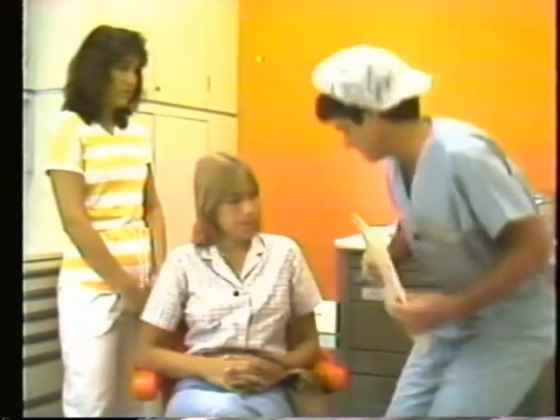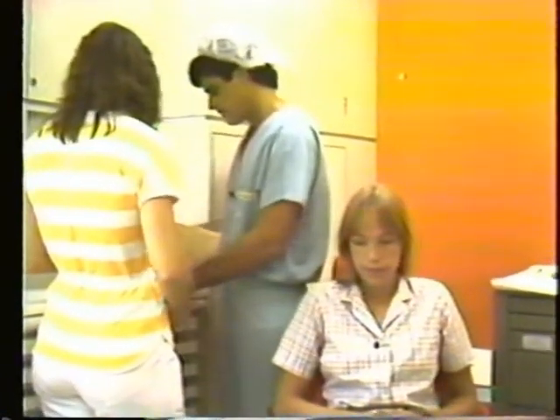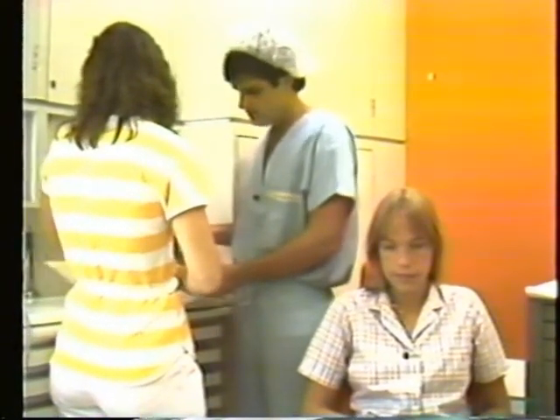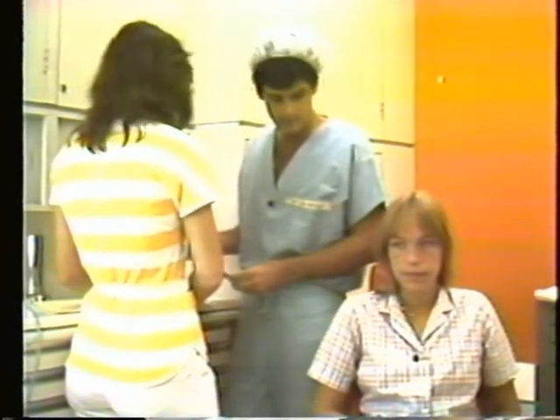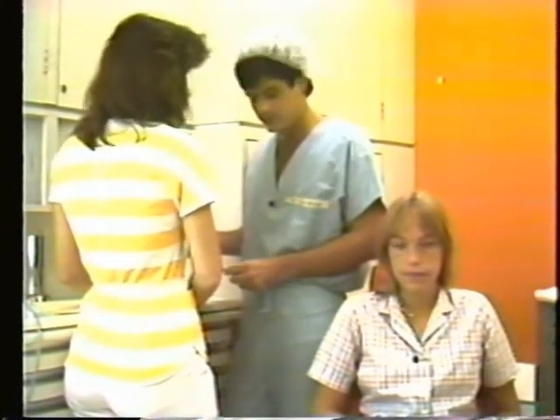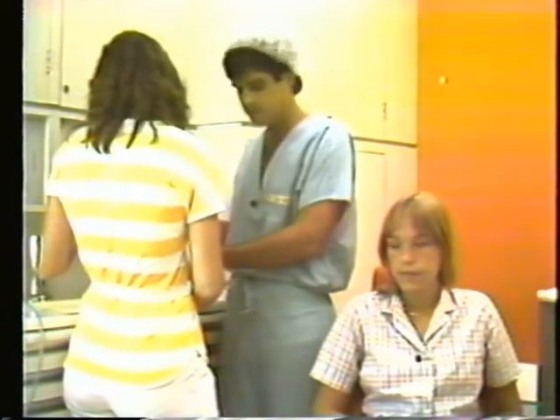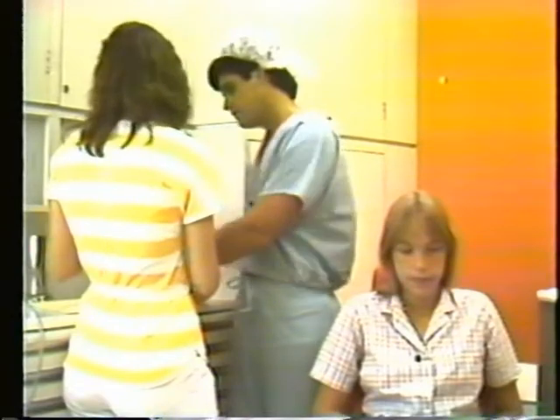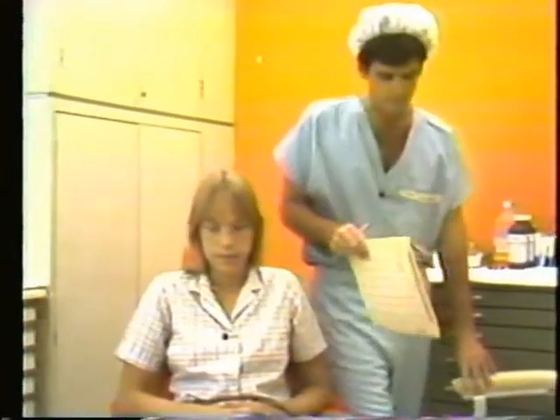After the patient is seated by the dental assistant, and before you start the history-taking interview, briefly pause and look at the patient. Is the patient male, female, young, old, heavy, slim? You may observe some conditions which you'll want to follow up on later in the history-taking interview. If you do, jot them down.